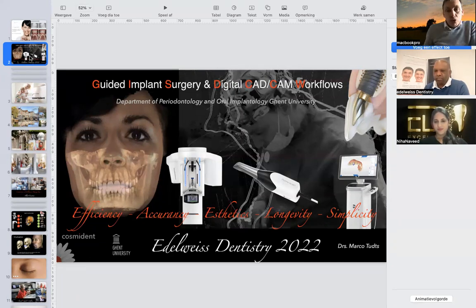Yeah, but that's the good thing, in my humble opinion, because if you have an implant like I showed you, and we see a lot of cases where we have to take out the implants because of a fracture of the implant caused by the very hardness of the zirconium, especially full zirconium.